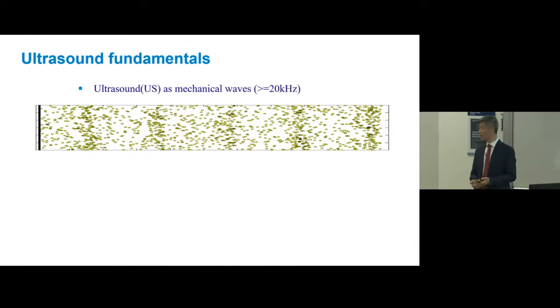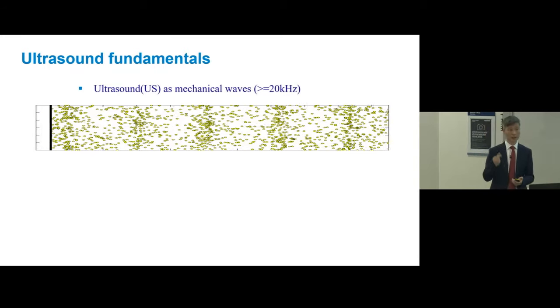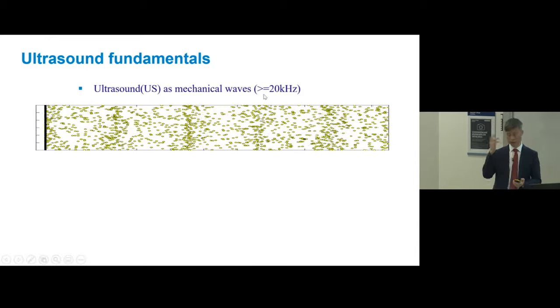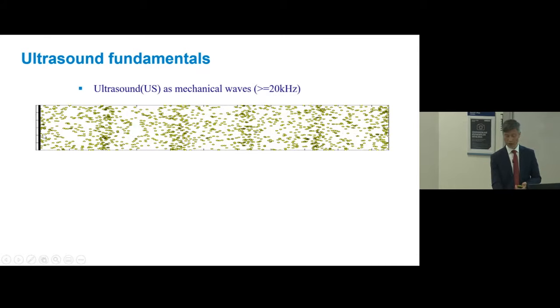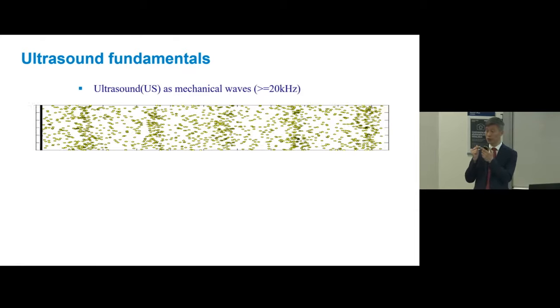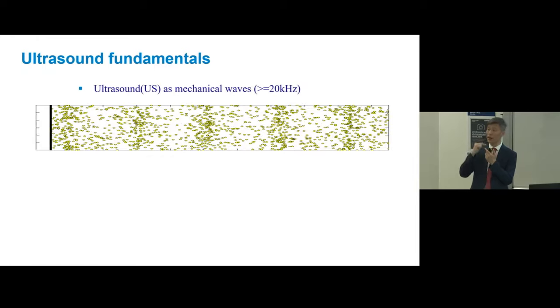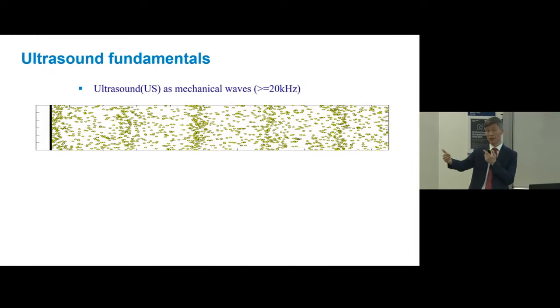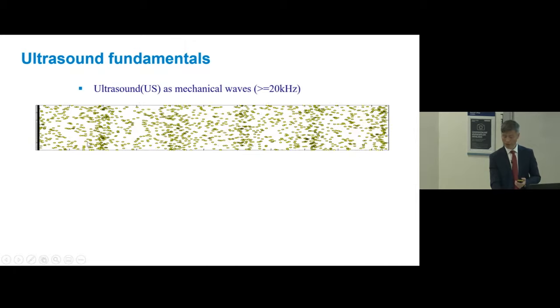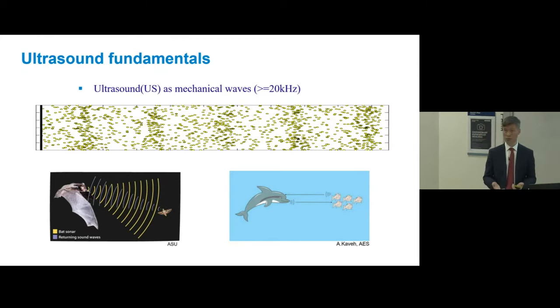Right, so the name of the talk is sound and bubbles, so I need to talk about sound, ultrasound. What is ultrasound? It is a mechanical wave. You can see this movie. It's a mechanical wave at high frequencies. You can't hear it with your ear, but you generate it with a piston or ultrasound transducer. In ultrasound imaging, all you do is generate a small wave, a short pulse. You fire it, and you just listen to the echo. How long the echo takes to come back from the object will tell you the depth of that object. And if you can focus your wave and sweep laterally, you know the lateral position of the object, right? This has actually already been used in nature: bats and dolphins use this principle to hunt their prey.